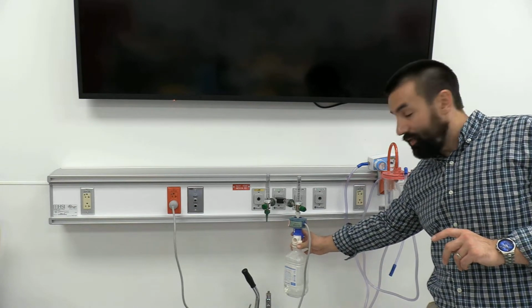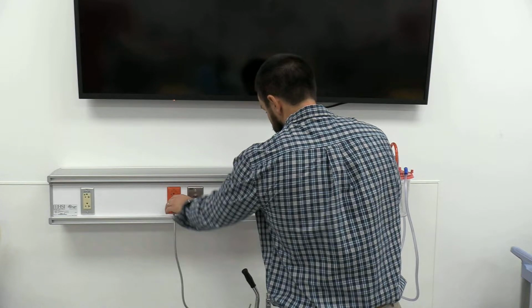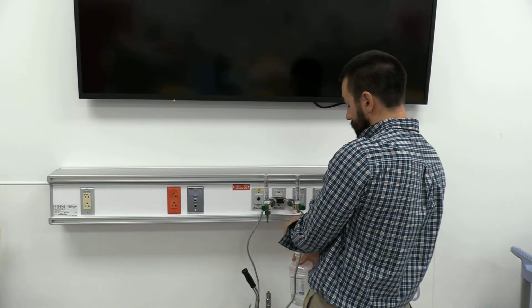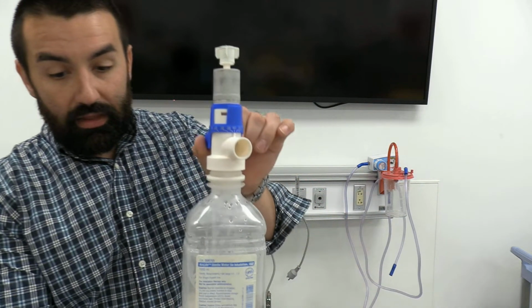Big mistake that these people made when designing these devices, okay? If you ever turn your flow off on this, even if the patient's coming off for a little while, you want to make sure you turn that off, okay? This thing can get really, really hot. You can see they let this bottle go up really high.